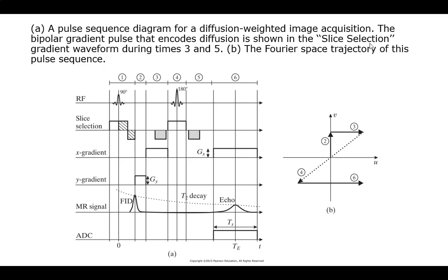Right? So now you want to make sure at every step you don't induce any more noise. You have to be very, very careful at each step. If you have a giant signal, you don't really worry about your signal to noise ratio. But if you've got a weak signal, now you do. As I go into more sensitive small signals, I care more about getting the signal teased out accurately.